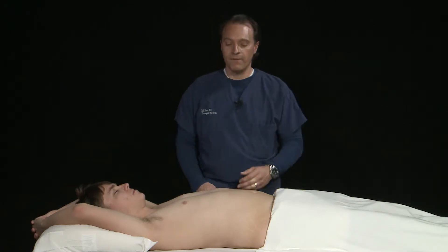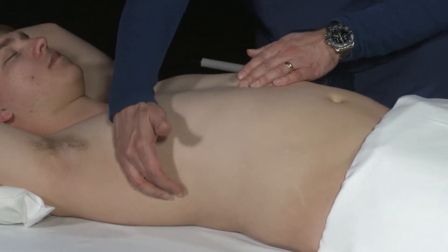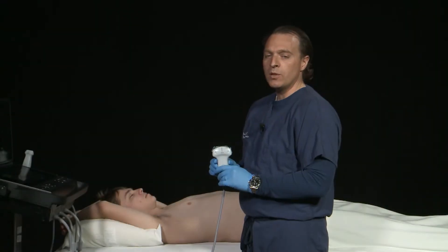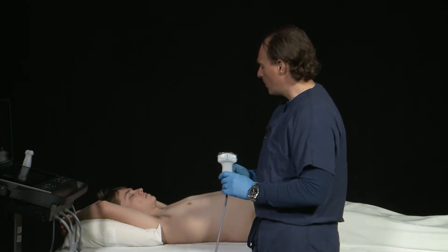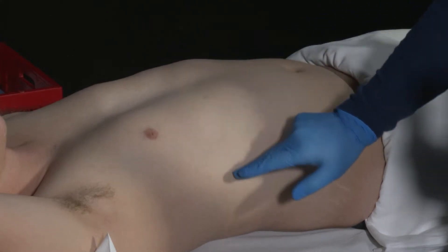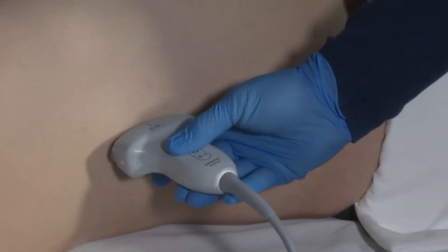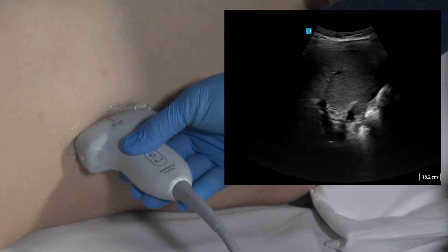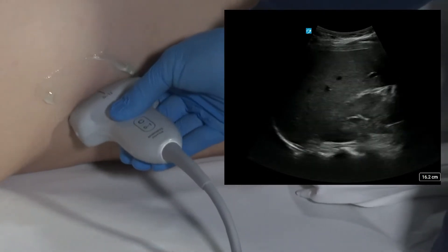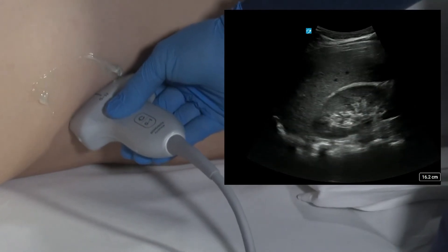To image the right kidney, we're going to use a curvilinear probe. We'll find the xiphoid process and draw an imaginary line from the xiphoid process to the mid-axillary line. We'll place our transducer in this spot with the marker dot pointed towards the patient's head, then tilt the transducer towards the patient's back to get a long axis image of the kidney. Moving the transducer around will help improve our view, and we may need to tilt it so that the transducer is parallel to the ribs.